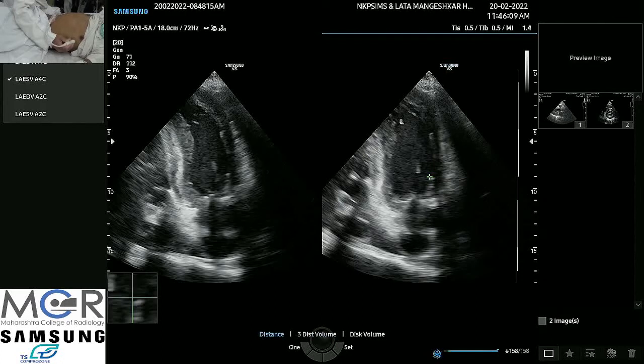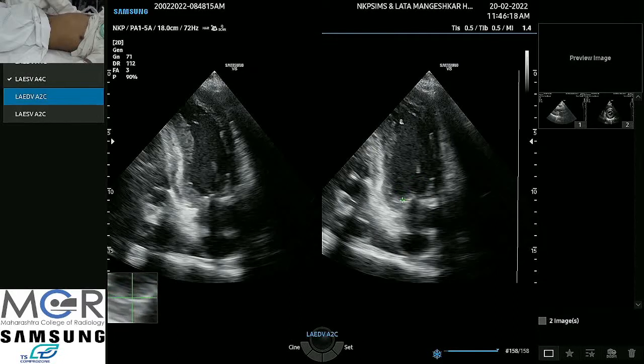This is diastole. Okay. This is systole. Which is this one? Okay. This is diastole.